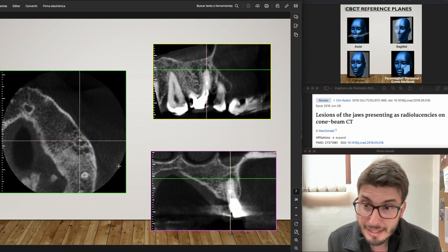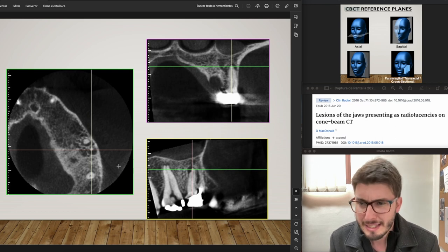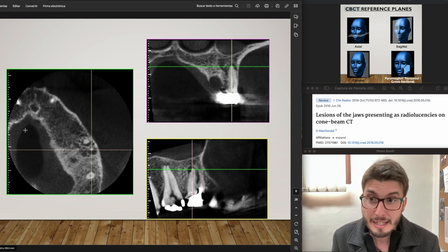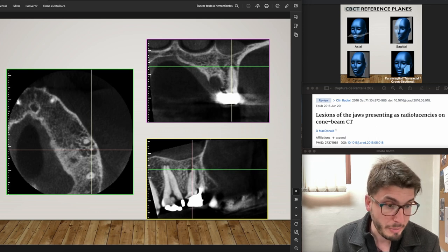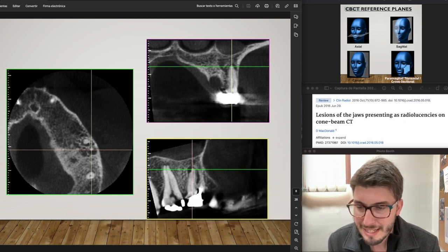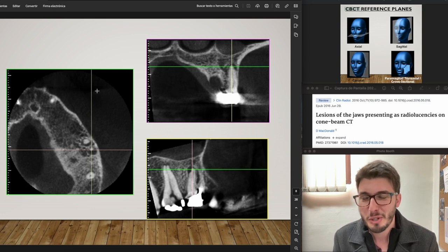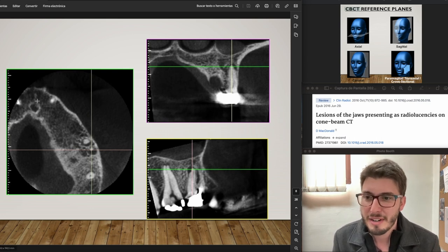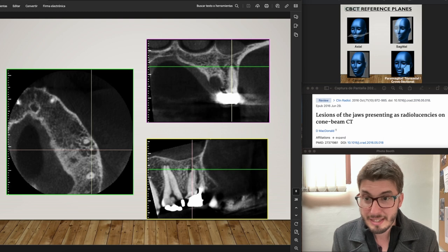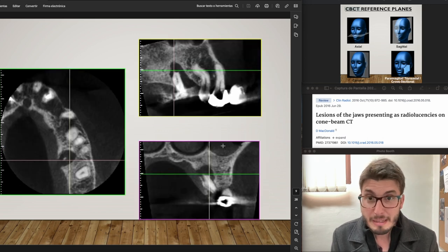This is the diagnosis of one root. Now we go for the distal root of this molar. The planes here are actually inverted, but it doesn't make any difference — it's the axial plane that always tells us which side of the patient we are talking about. The assessment is happening on the left side of the patient because it's the right side of your screen relative to the axial plane. Now we have the distal root situation and the continuation of this periapical lesion to the furcation area.